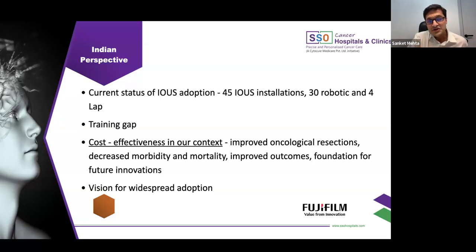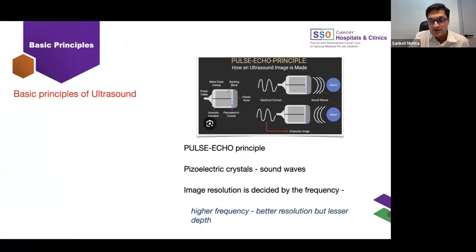In fact, intraop ultrasound would tremendously drive cost effectiveness. In a country where you can afford 300 robots, we are not having intraop ultrasound, which makes the surgery much more economical because of improved oncological resections, decreased morbidity, performance of one stage liver resections for multiple liver metastases, and various other innovations that can be founded on the principles of intraop ultrasound. So I think it is on us to increase the adoption of this revolutionary technique, and we should have this vision as a part of the goals of this webinar.